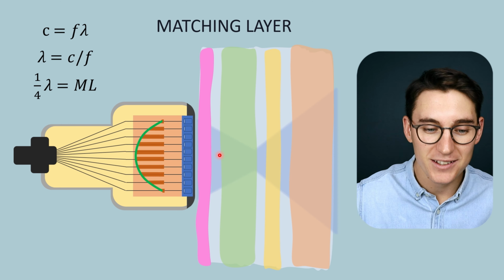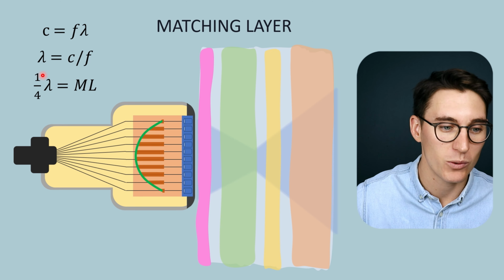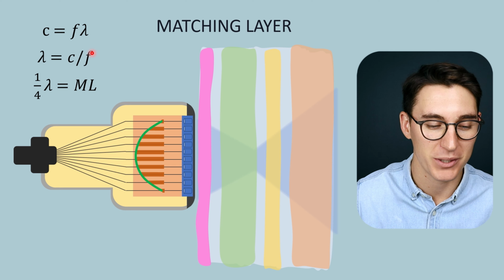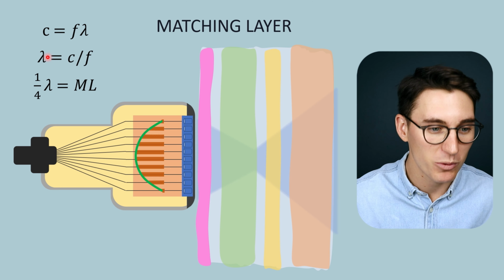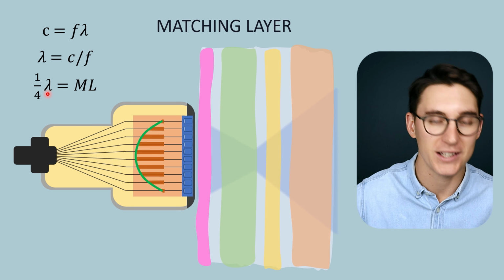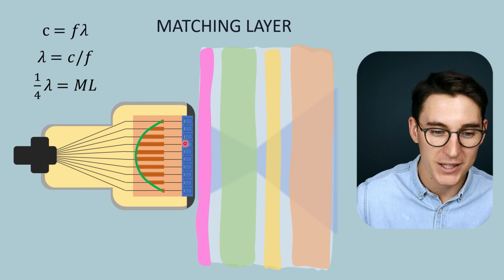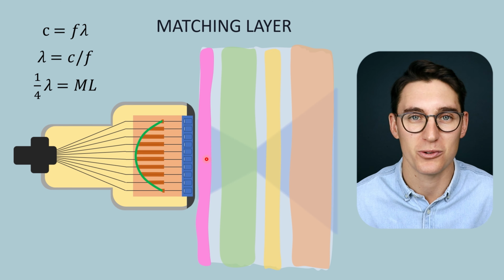It depends on what material that matching layer is made of. Now, in order to not hinder that ultrasound wave that we are creating, we want our matching layer to be a quarter of the wavelength of the sound that is traveling through that matching layer. So we will have the speed and we will have the frequency. The frequency set by our PZT layer, the speed determined by the material that the matching layer is made of. Then we will be able to know what the wavelength of the sound traveling through our matching layer is. A quarter of the distance of that wavelength is how thick we want our matching layer to be. So our matching layer thickness will be dependent on our PZT layer, because the PZT layer determines the frequency that the sound will be traveling through tissues.